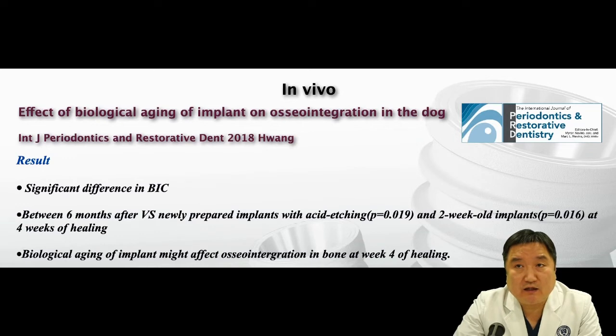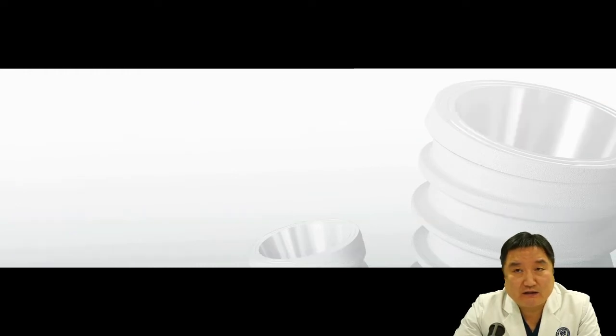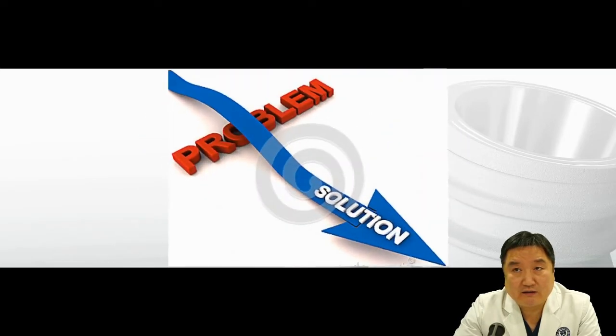The result shows that there was a statistically very significant difference between the group of 6 months after manufacture versus the newly prepared and 2-week-old implants at 4 weeks of healing time. So we were able to prove that the biological aging of titanium will degrade the osseointegration process. Okay, now we have concrete evidence that time affects the bioactivity of the titanium surface. So then, what could be the possible solution for that problem?